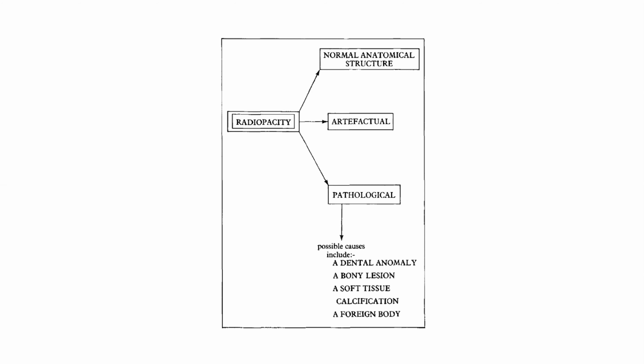Alternatively, it can be artifactual. That means they can be real or ghost earring shadows, fixer solution splashes, objects, or scratches on intensifying screens. And thirdly, they can be pathological, which we're going to focus on here the most.